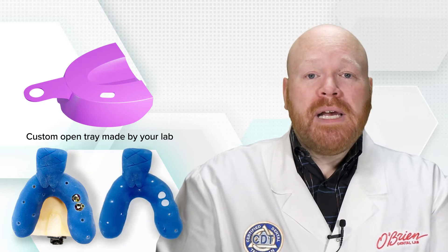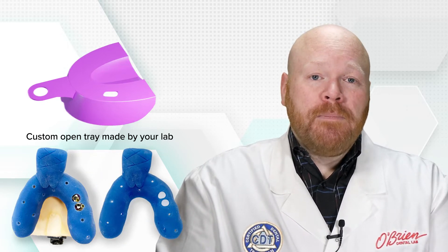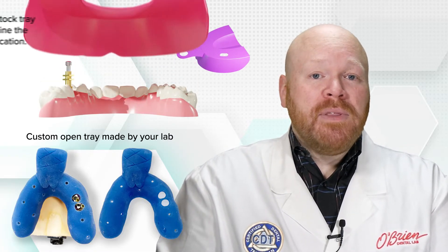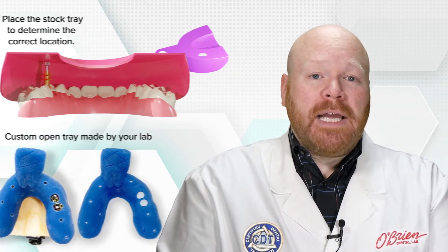The other thing you'll need is a tray with a hole in it at the site of the implant. Your lab can make you a custom tray with the hole already in place, or you can take a stock tray and create the hole with a grinding burr. If you're going to create the hole in a stock tray, it may be easiest to determine the correct location of the hole after you've placed the impression coping on the implant.